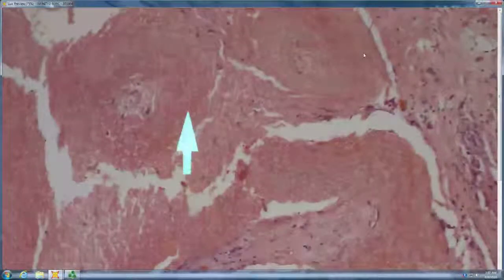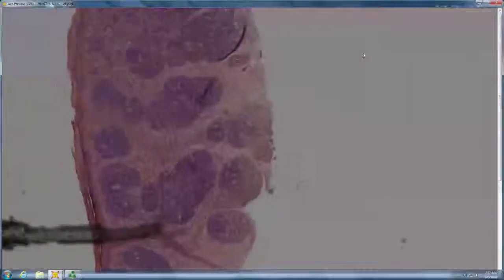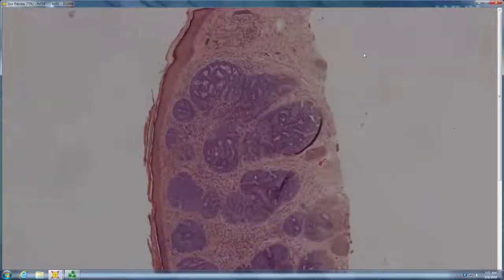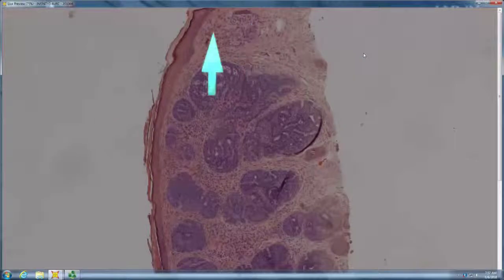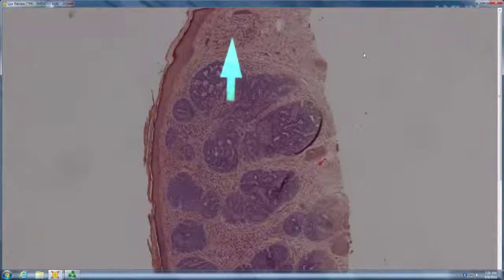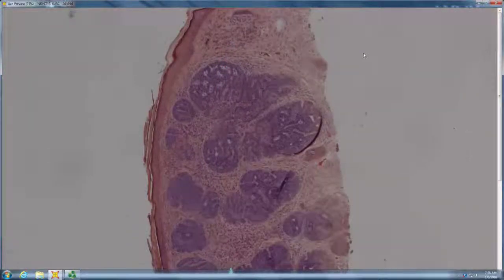This is another pilomatricoma. Another pilomatricoma, you certainly have shadow cell differentiation. Basaloid cells and fibroblast-rich stroma, trichoepithelioma or trichoblastoma. And what is that big thing there? Those plump gray cells forming a ball. Oh, there's another one here. Those are the famous papillary mesenchymal bodies that are normal in that stroma. Well done.